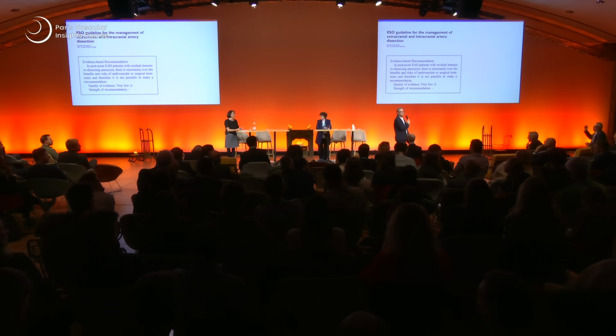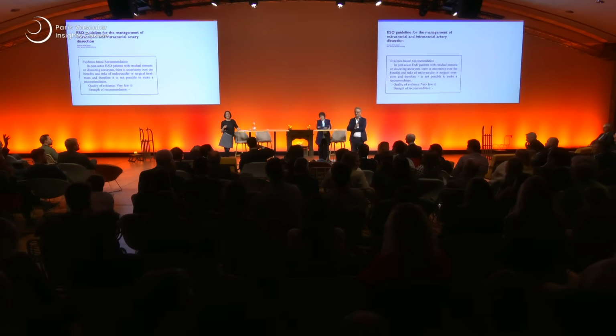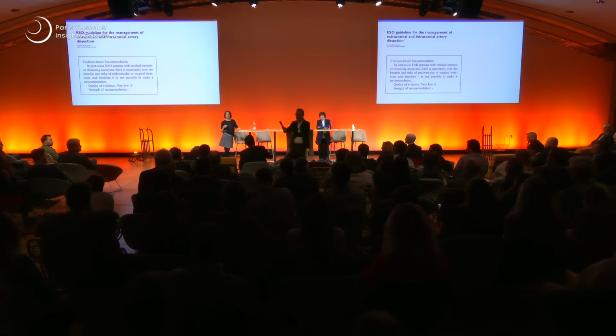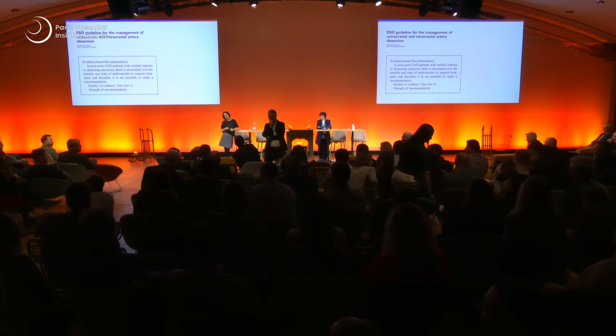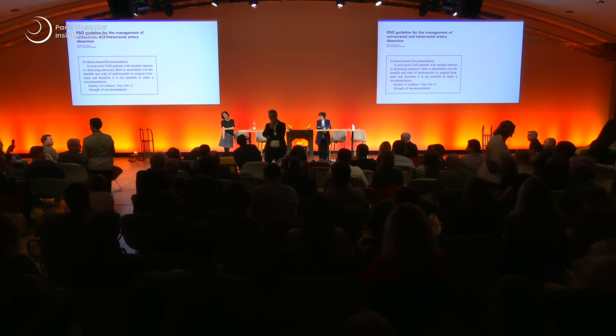Then dynamic MRI. She obviously has some problem. I think now she needs an angiogram, transfemoral angiogram, being prepared for going from up and from down in the setting. A therapeutic angiogram. An angiogram with an idea of proceeding in treating position. Yeah, therapeutic angiogram. More ideas? Is she clopidogrel resistant or not? No. She was a responder. Angiogram, I would consider the dissection on the innominate trunk to do a selective angiogram.